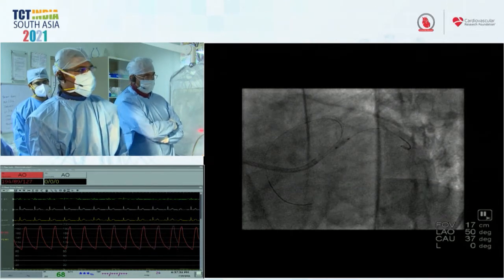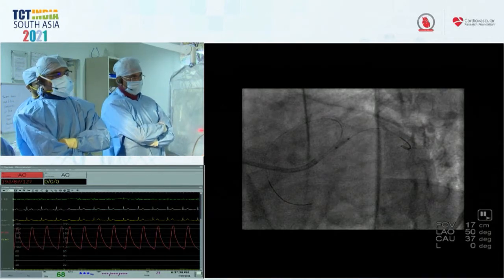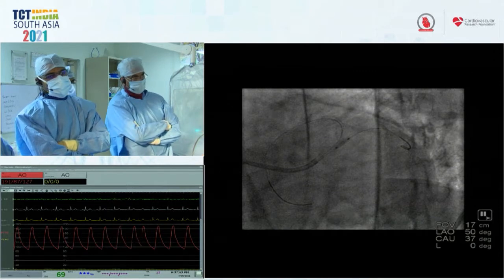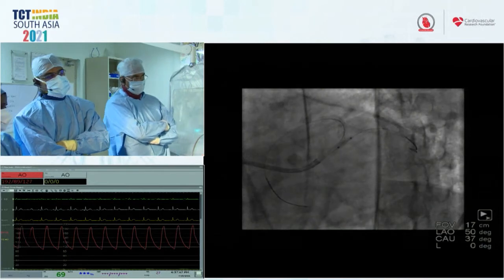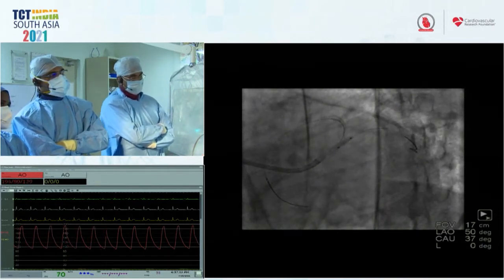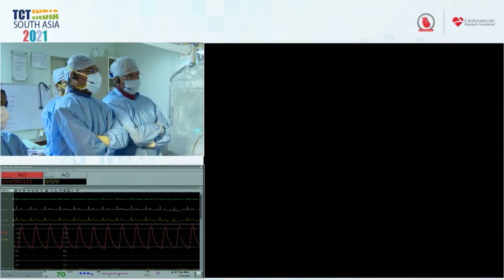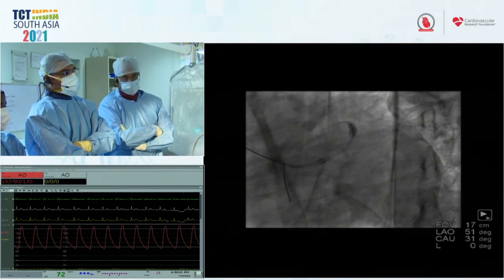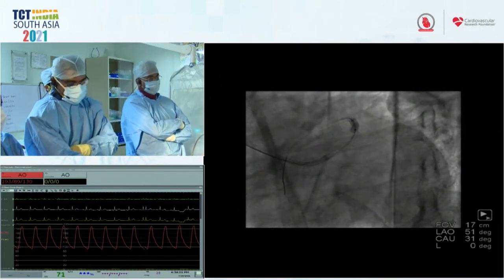Well, I wouldn't do that. I just wanted to open that ostium up, because if we put a stent right across from the ostium of the left main to the underexpanded stent, which we would obviously fix with high pressure balloon dilatation with a single long stent, we would be putting a lot of metal across that circumflex ostium. So I just wanted the circumflex ostium to be opened up first. If you have any issues, then we will think about it later. This was a plan between me and Vijay. Okay. And Dr. Mustafa, what about you?